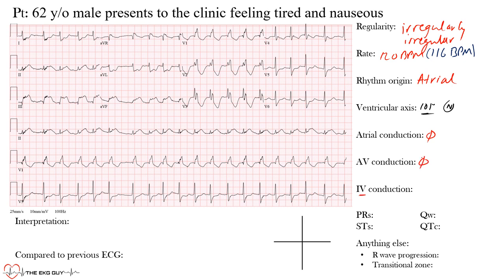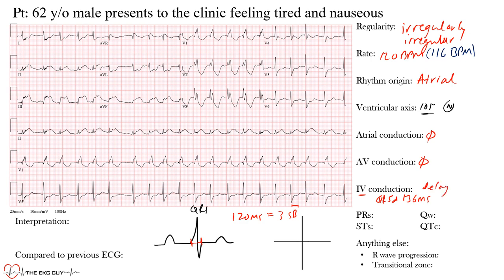Next is intraventricular conduction. Normal QRS duration is less than 120 milliseconds — that equals three small boxes on the EKG grid. The machine gave us a QRS duration of 136 milliseconds, which is prolonged. So we have a delay in intraventricular conduction, and we'll soon see the reason for that.